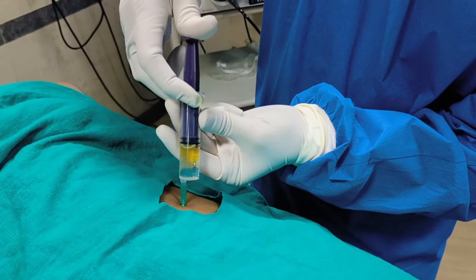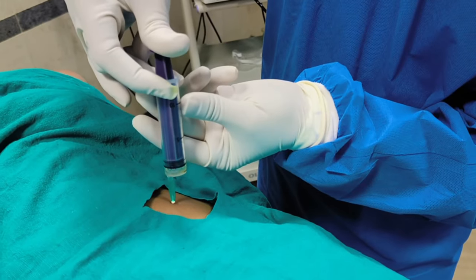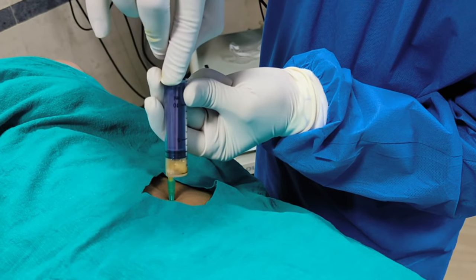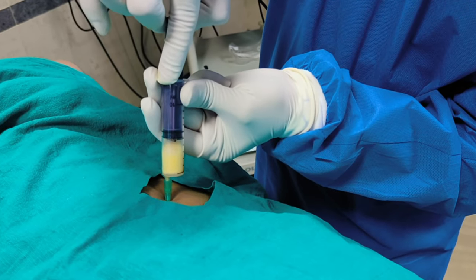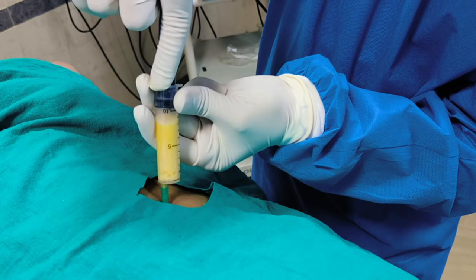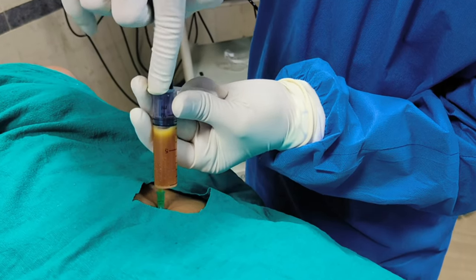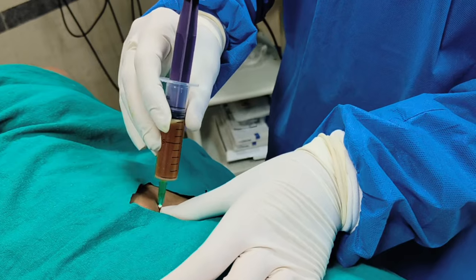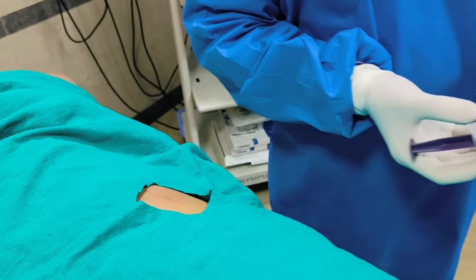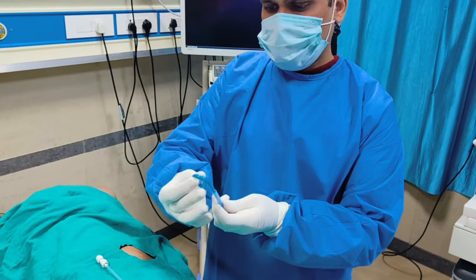We are going centimeter by centimeter inside, and we have to confirm by aspirating. You can see we have reached the pleura — we will aspirate it. This is hemorrhagic fluid, which means our site is the correct site, there is no doubt about that. We have to wait 30 seconds to one minute for the local anesthesia to take effect.